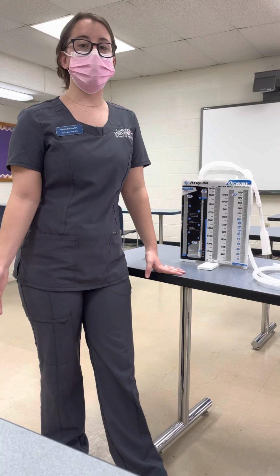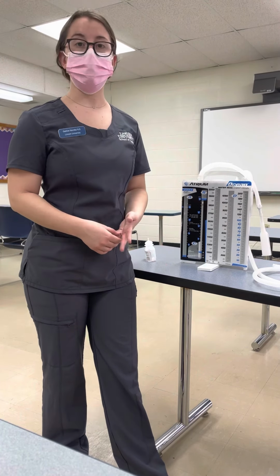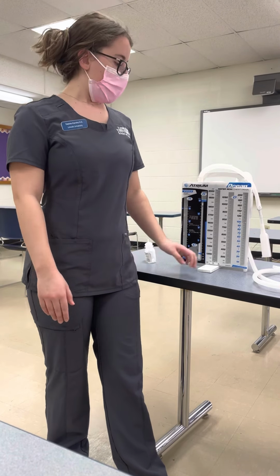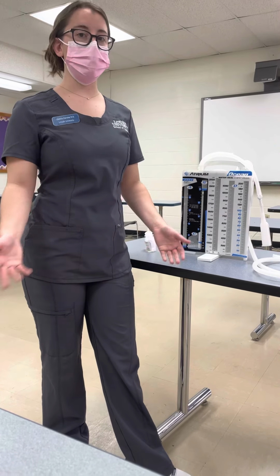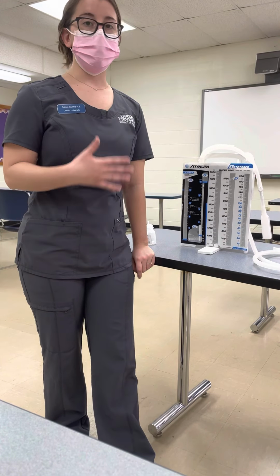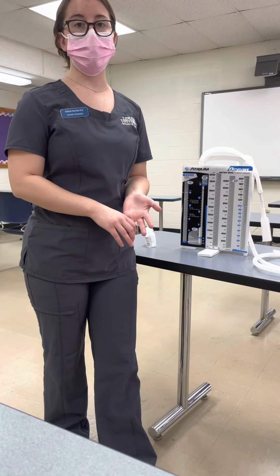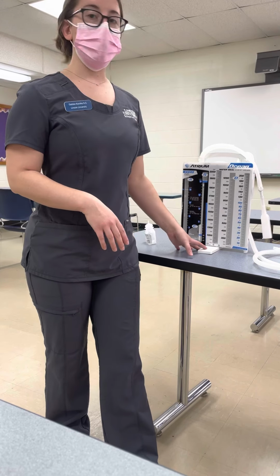And then we also just want to have them cough and deep breathe regularly as they need to work on re-expanding their lungs. Once this is discontinued, we can explain that procedure to them. So usually this is only placed for about 2 to 3 days depending on the lung re-expansion and depending on imaging. So if imaging looks good and their lungs are re-expanding, the physician will order to discontinue the chest tube.